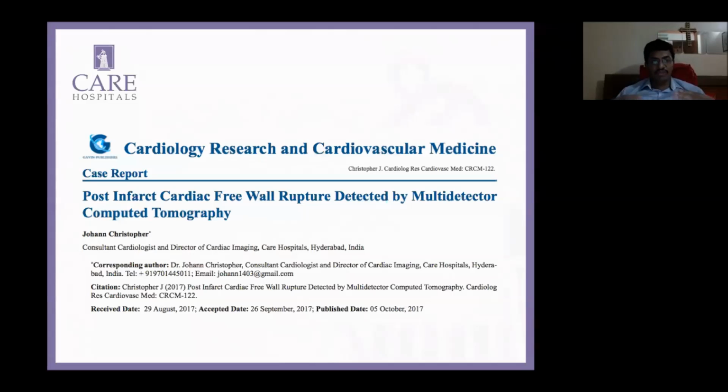You have to have some very good software to really look at what I call the first pass run, which most people won't really see. The first pass run of gadolinium will really show that. And I have a picture, I'll share it with you. That's the only place where you will see the contrast leaking out of the cavity into the endocardium. It's not easy to see even with practiced eyes, and many times you'll just gloss over it. And the biggest drawback, you don't get the coronaries, to me the holy grail of the next step for this patient.